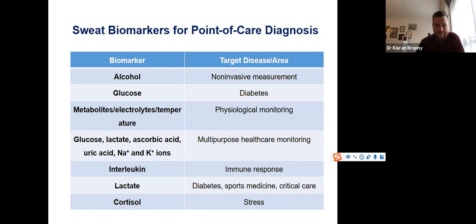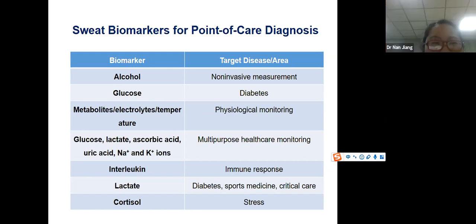So the current holographic sensors that we develop use a hydrogel substrate, and we know hydrogel cannot live without water. So the current storage method is that we need to put it in water, sometimes in PBS, the phosphate buffer solution, to keep it. This is also a challenge, that these sensors cannot live without water.